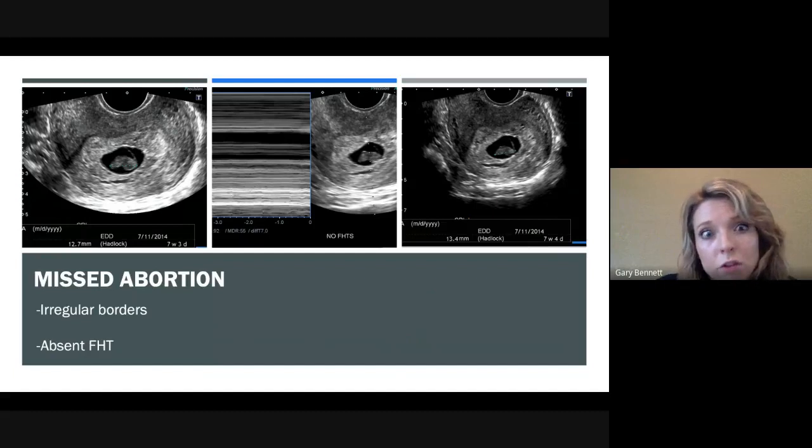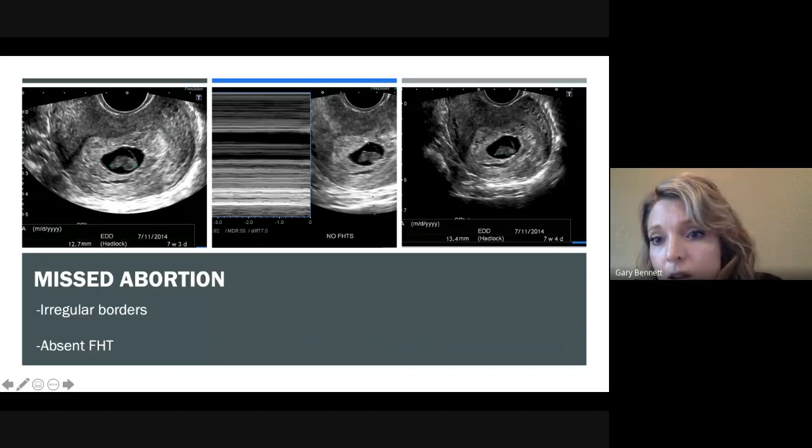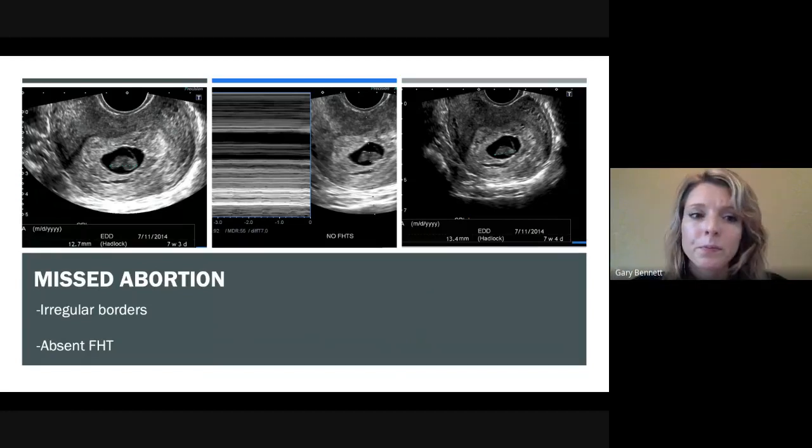In fact, it's almost never a circle, but you don't see these jaggedy lines on the edges. Right there, you can see those wiggling down. I'm not 100% sure you guys can see my arrow. Hopefully you can. And on this third image, you can see it a little jaggedy on the sides there. It doesn't look like it's really full, like maybe it's starting to involute a little bit.